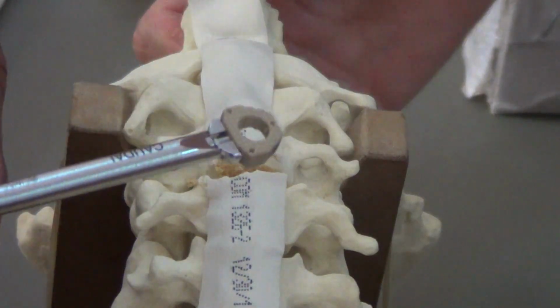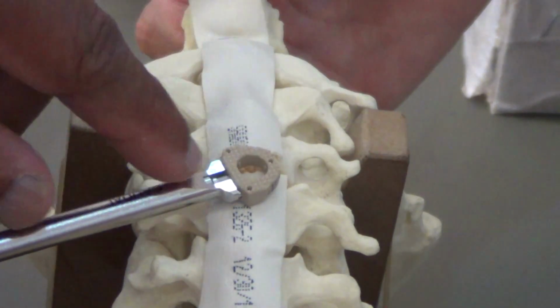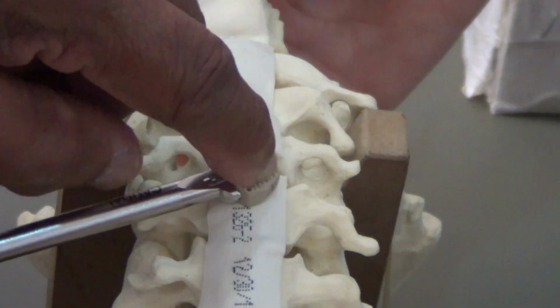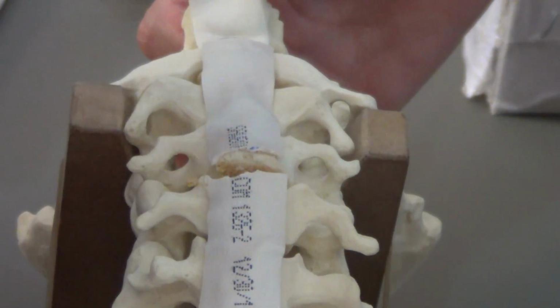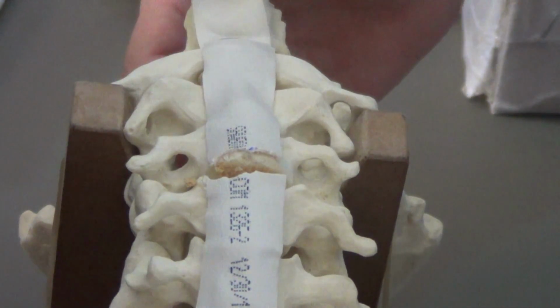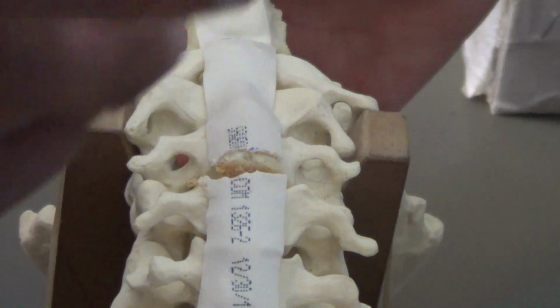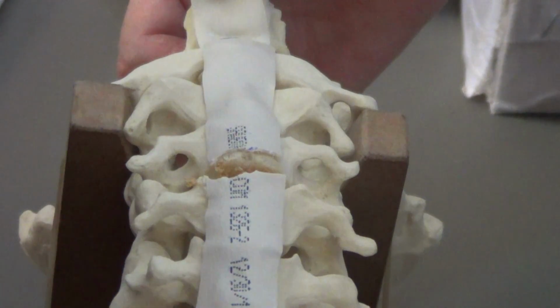You see, this is a cage. You find there is a teeth cage, there is a hollow in the center, and in this hollow we can put a bone graft, either a bone allograft or autograft bone graft. And then how do you judge which size of bone or which size of cage to be put?